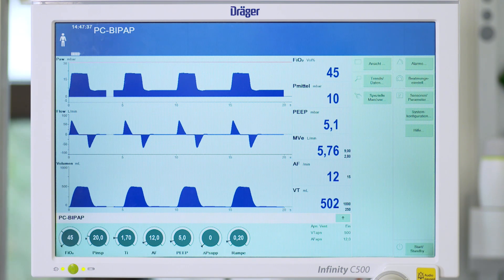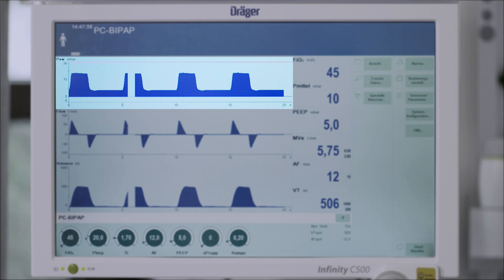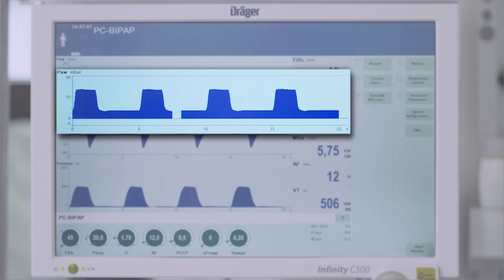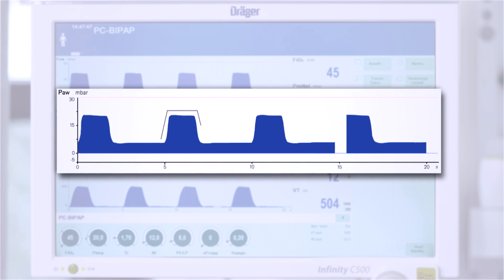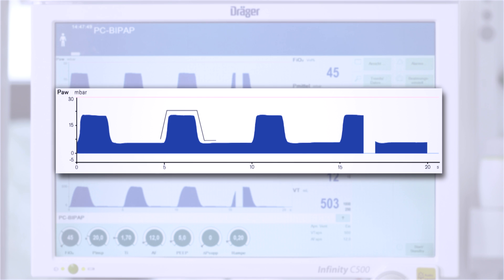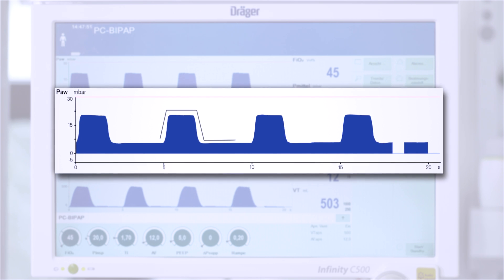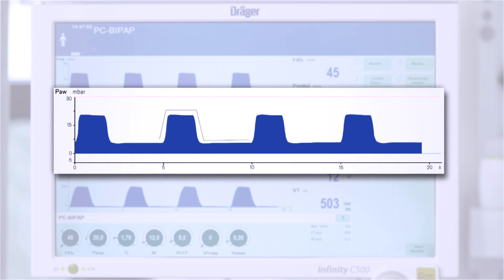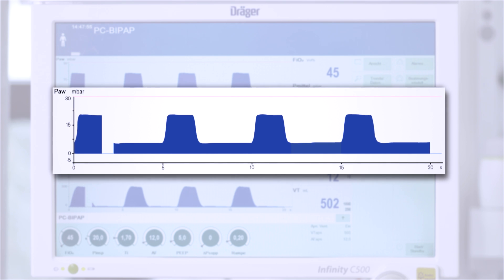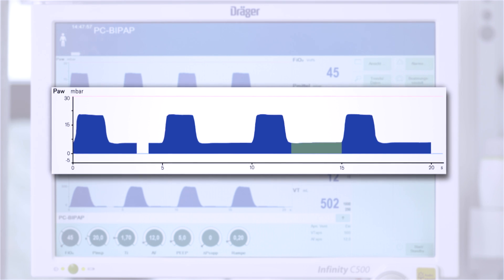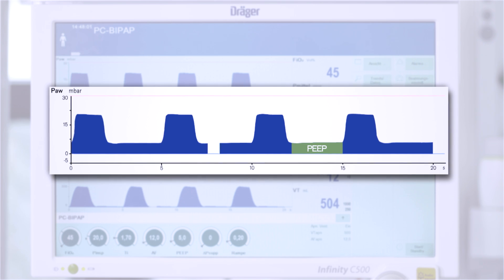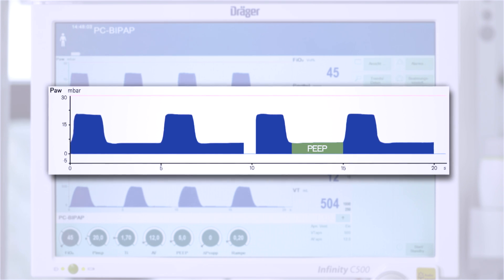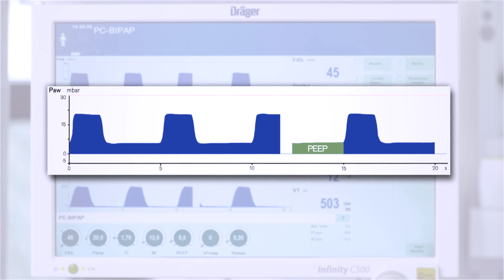The screen shows curve diagrams. The pressure curve is seen above. Every time the breathing device switches to inspiration, the pressure increases — with this patient at 20 mbar. After that, the curve falls down, meaning the air flows back out from the lungs. Unlike in our experiment, the breathing device now maintains a positive end-expiratory pressure, called PEEP, in the lungs.